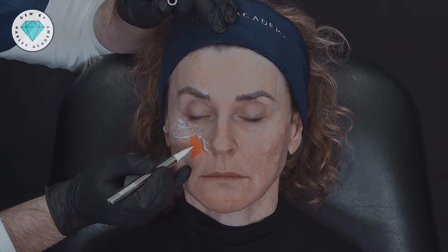And so the best way to get into this deep fat pad compartment is to try and find a way to either get your cannula into the deepest possible plane underneath both the SMAS, layer 3, and underneath the levator labii superioris. Alternatively, we can use a needle and treat it down onto bone. In this case, I'm actually going to use a needle.